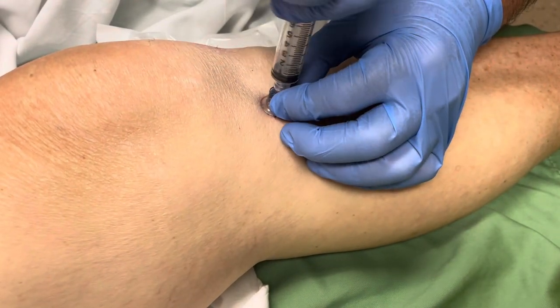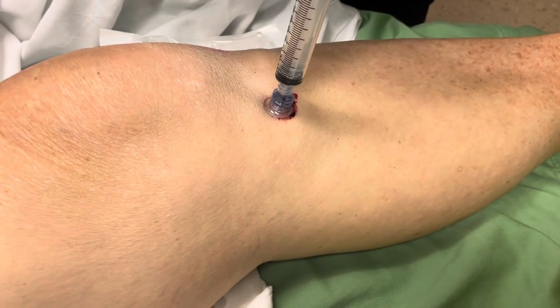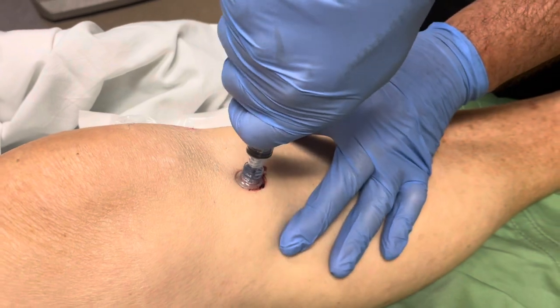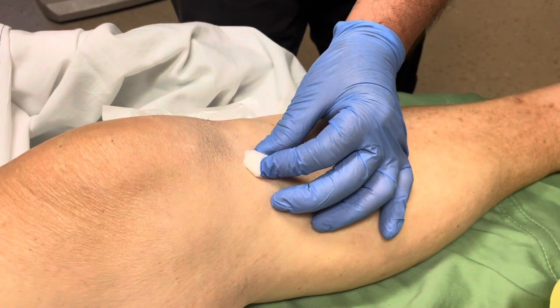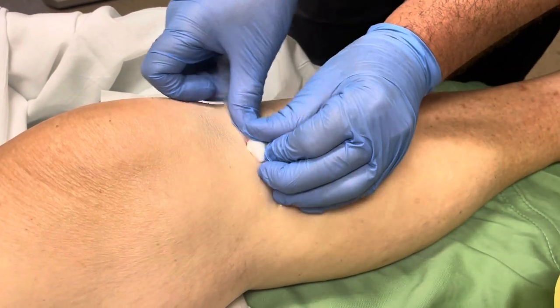Let the patient know that they'll feel a tug, and have a piece of gauze ready. All right, you're gonna feel a little tug, okay. Place the gauze, drop the sharp into a sharp container, and secure your gauze.